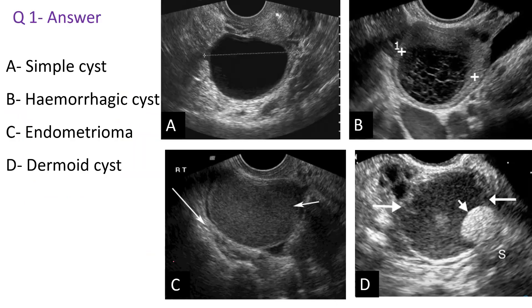The answer to question one: picture A is a simple cyst, B is a hemorrhagic cyst, C with a ground glass appearance is suggestive of endometrioma, and picture D with mixed echogenicity, echogenic nodule, and hypo-acoustic shadow is suggestive of dermoid cyst.